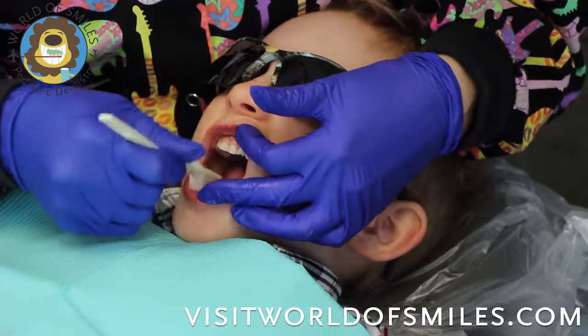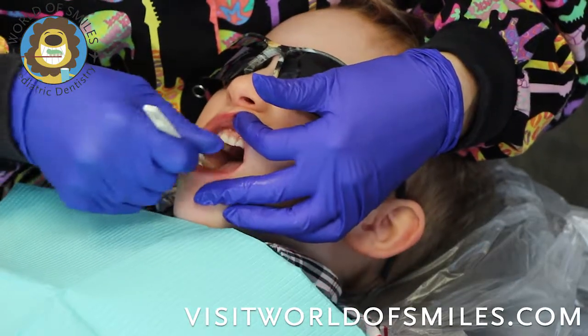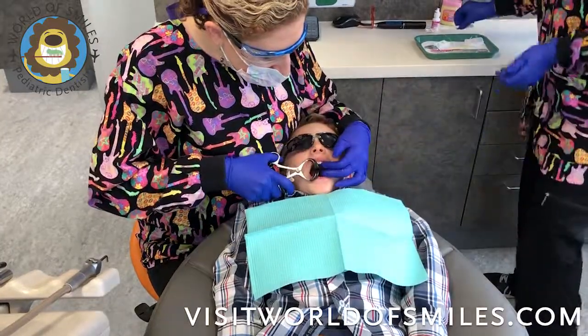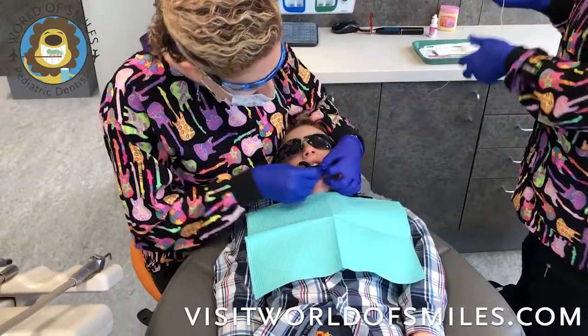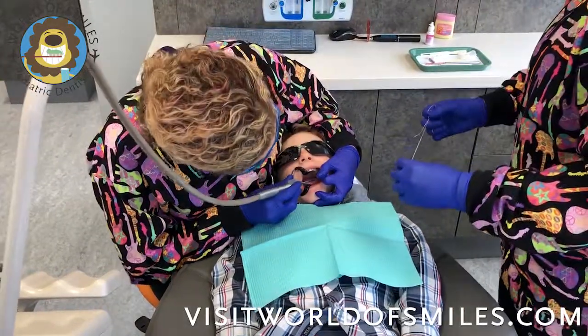Good job, you're doing so great. And then we'll use a mouth prop in order to keep his mouth nice and open, and a dry angle so we can keep that area isolated. You can use the air water in order to dry it, or a 2x2.